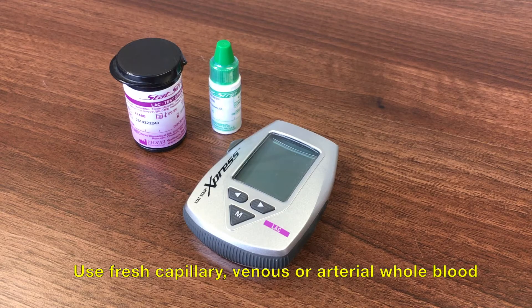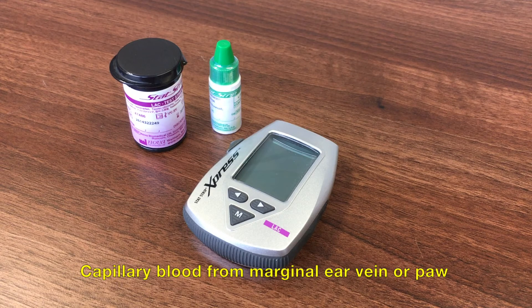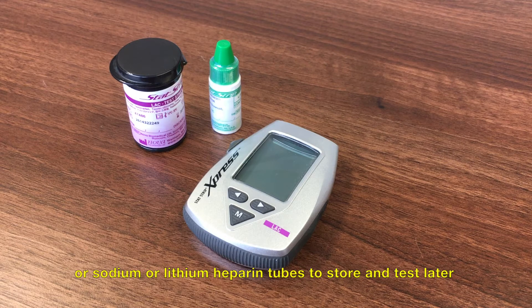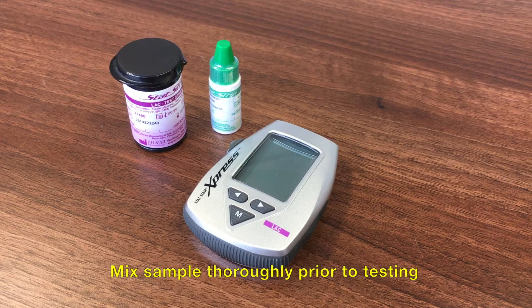To test a sample, obtain a fresh capillary, venous or arterial whole blood sample. Take capillary samples from the marginal ear vein or from the animal's paw. Venous and arterial blood can be taken into a plain syringe for immediate testing, or use sodium or lithium heparin tubes if the sample is to be stored for testing later. Mix the sample thoroughly prior to testing.